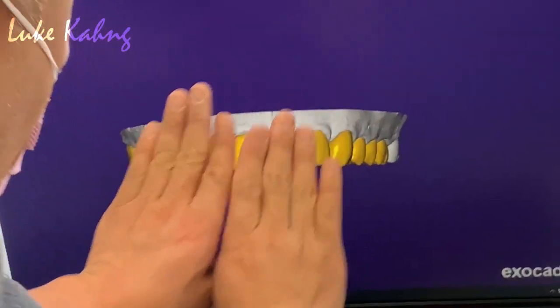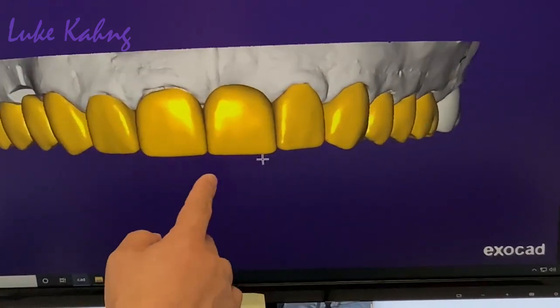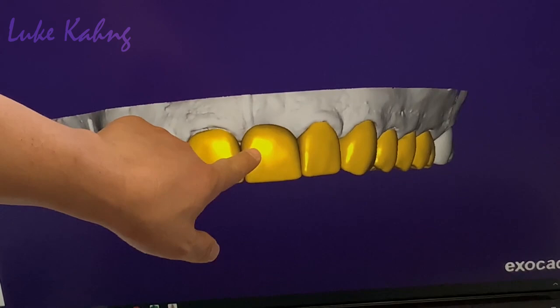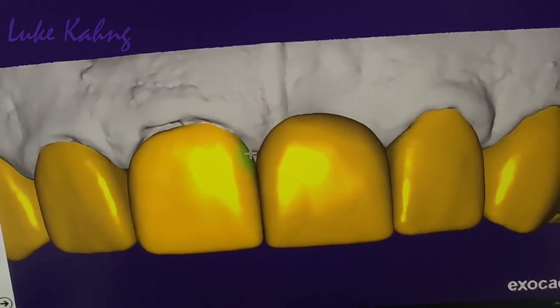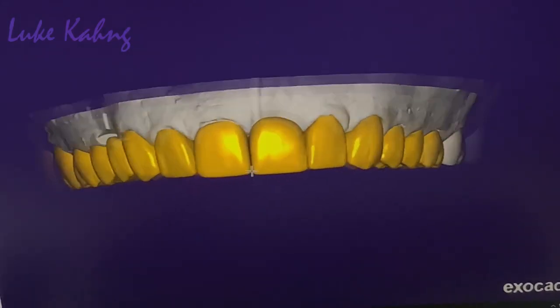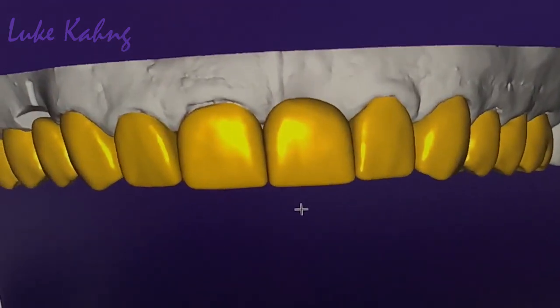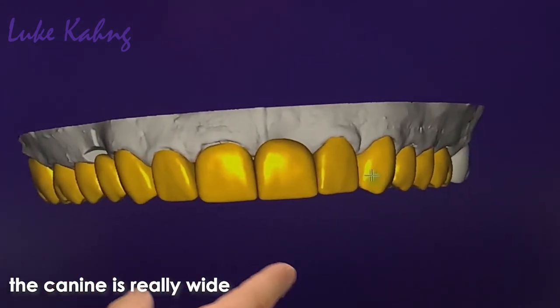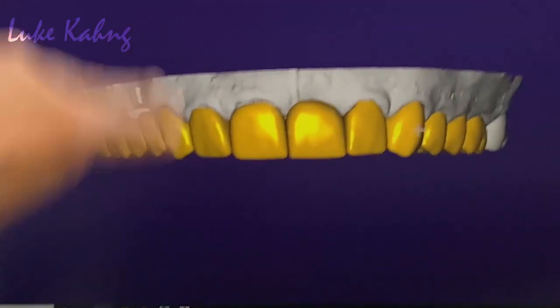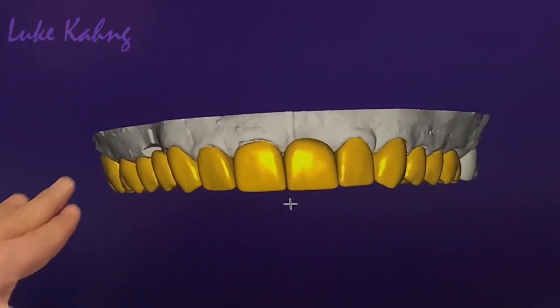So, two teeth. This one, move it. This one, move it. Yes. But this gingiva, you can add a little bit. No, no, no, this is fine. Only this. So now if you look at this canine, really wide and fat. This, bring it in. Right? Slightly higher is okay. Canine high. Yep. Okay. Now this is better.